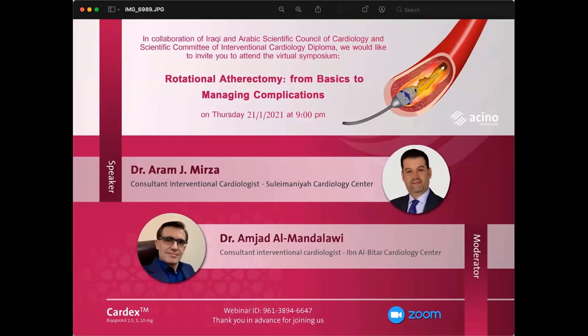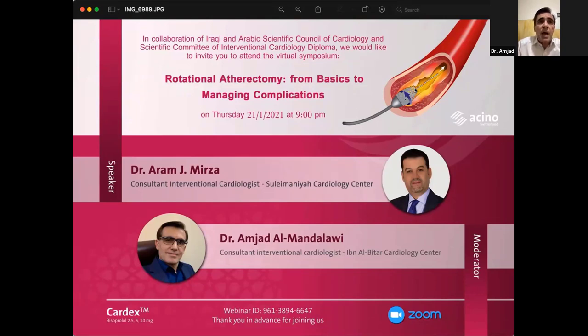Dr. Ahmed Adib, I think he is asking an important question: are you always going to plan rotablation, or do it as a bailout procedure? Elegant question, very elegant. It's a very important question. Definitely, yes, planned. The same story for left main stem, the same story for CTO. Never try to do rotablation in an ad hoc procedure.